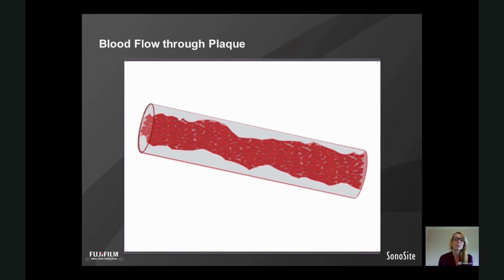Whereas you can see in this vessel is another example of what we would call non-laminar flow or restricted flow, where it's travelling through some resistant areas or some narrowing. When blood is running through a tube and then there's some narrowings in it, that can either be from plaque or what we call neointimal hyperplasia, which causes a lot of the vein stenoses.